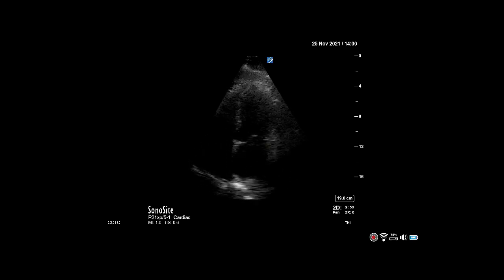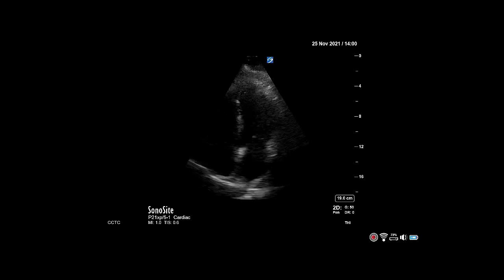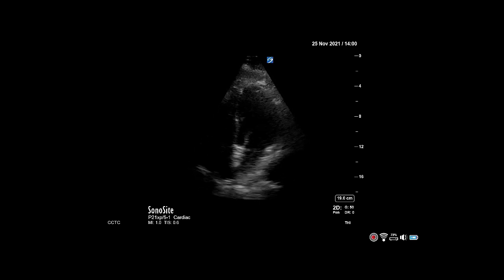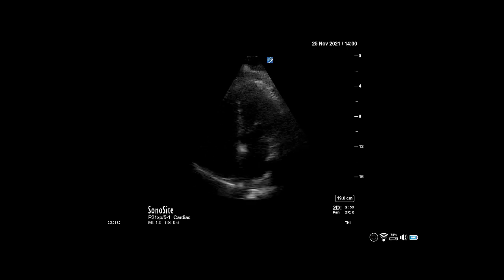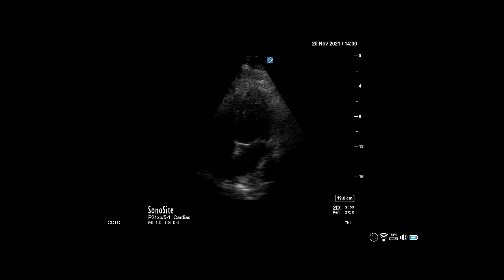Left atrial pressure is a useful measurement to help determine if bilateral B lines on lung scans suggest cardiogenic pulmonary edema or not.